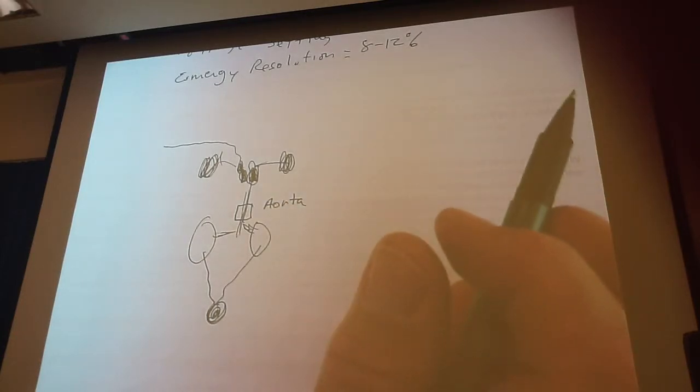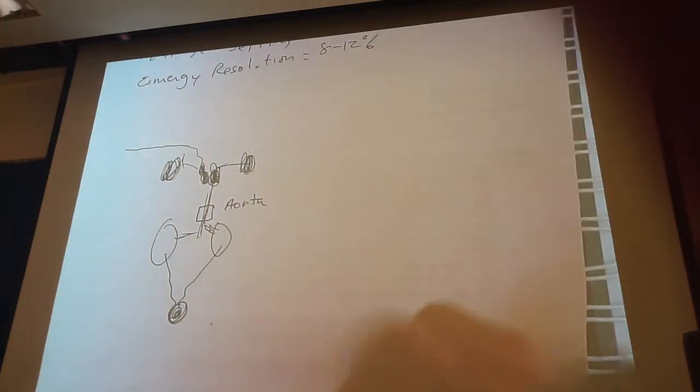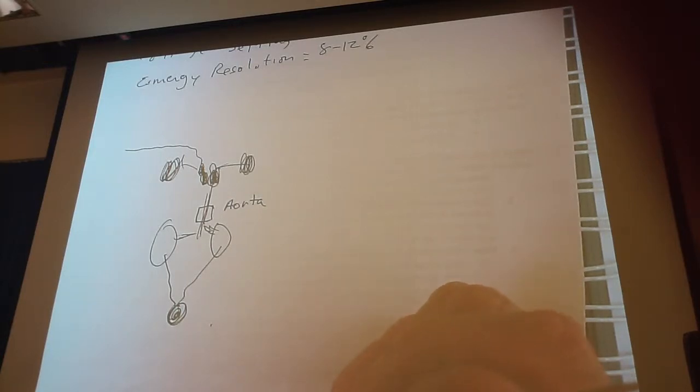And typically you put a region of interest over the aorta, correct? Have you guys done all, have you all processed it? Okay, why do you put it over the aorta? To do what? Take out the aortic counts or something? No. Compare them? No. Well, you're doing a couple of things with it.